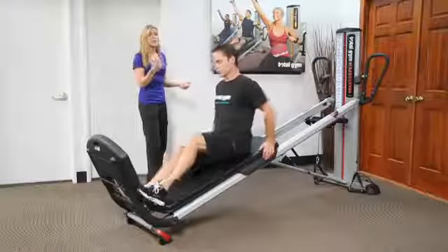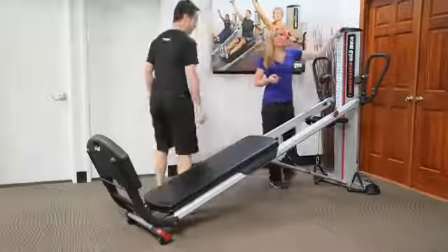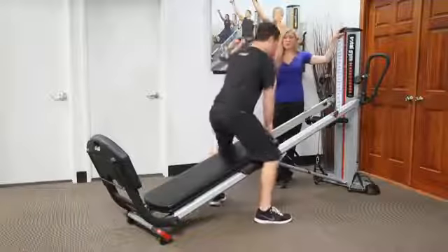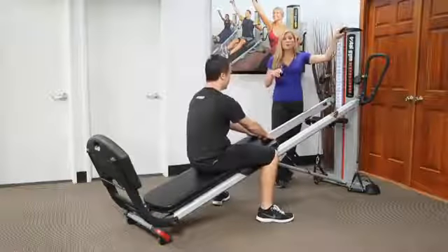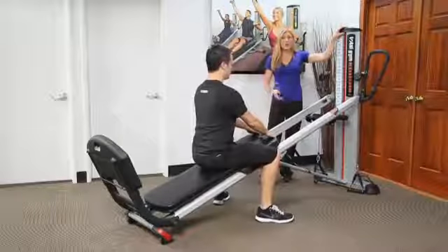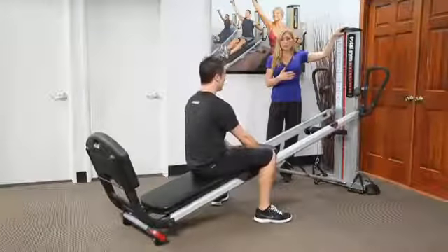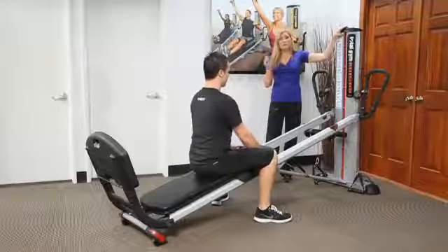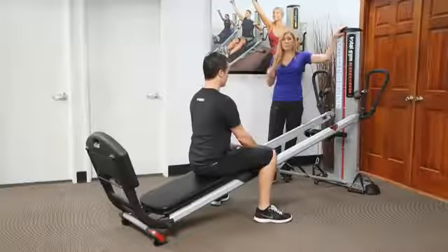Now I'm going to have him go the other way — sitting facing the tower. We do a lot of rowing exercises here. Remember, when you face the tower, the higher the incline, the more the person is likely to go into a posterior tilt because of the tightness of the hamstrings. You have to remember that when you face the tower, hamstrings become more challenged. If that's the case, remember that glide board tweak — we can bring the glide board up to accommodate for hamstring flexibility.